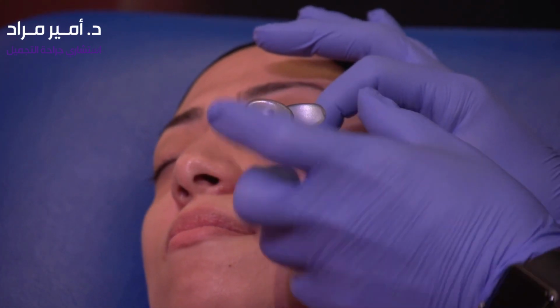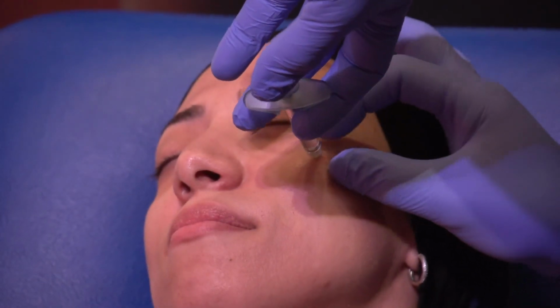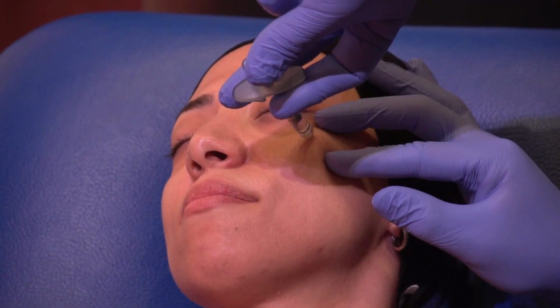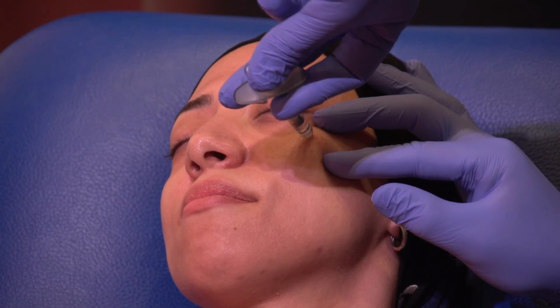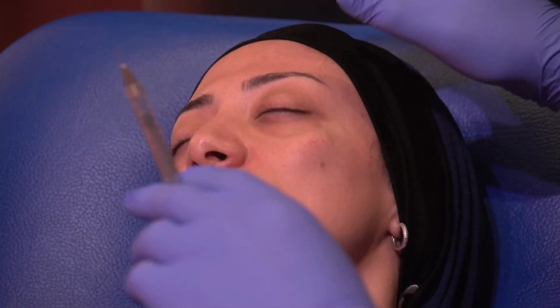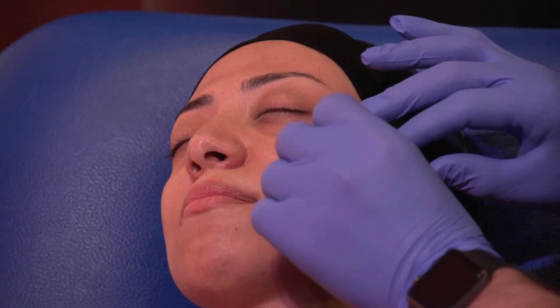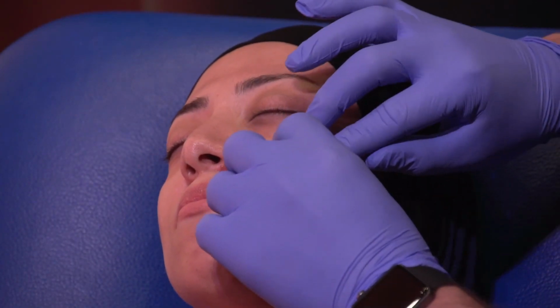So you're drawing that cheekbone, okay? And you can see here, I inject on the bone. I'm not sure if this is clear. Another 0.2 to 0.3 on the bone. So that's almost a full needle. I use alcohol swab again. Some of you would use a gauze here to clean the blood. I use alcohol swab. I might massage the product just a little bit to spread it.